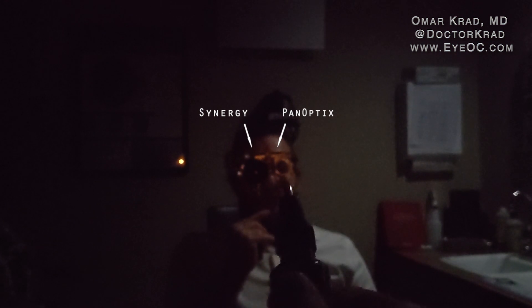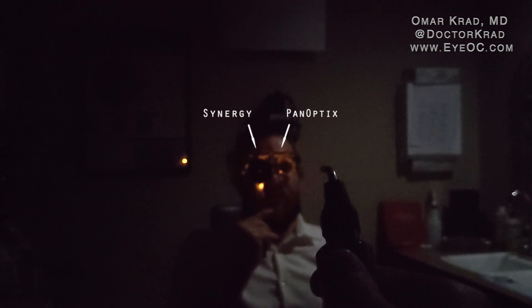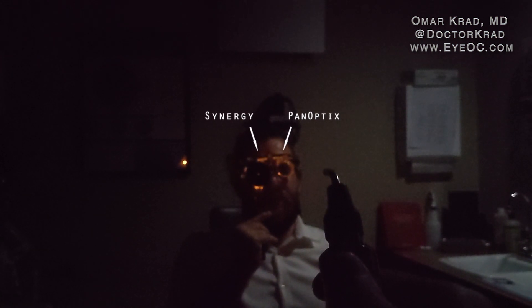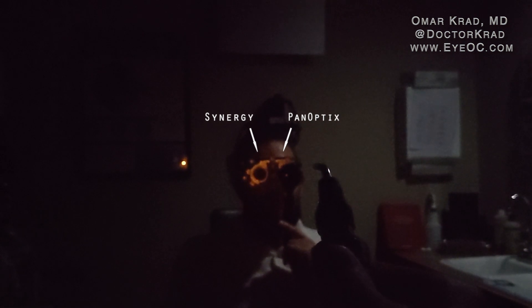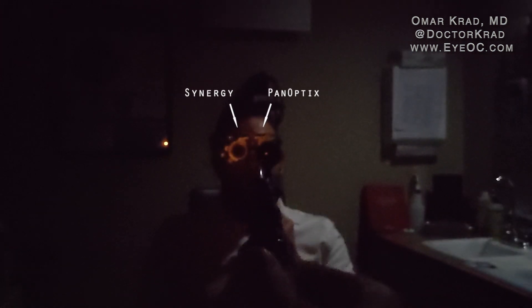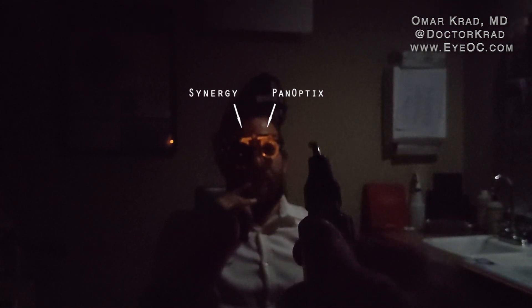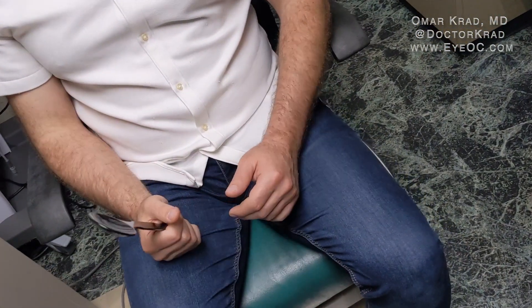Comparing the two eyes with the headlight, the right Synergy lens has a bigger halo and starburst for sure. The patient notes that the left PanOptix eye has improved significantly since right after surgery when it was pretty bad. Overall, vision with the headlight is better with the PanOptix, and the point of light looks a little bit sharper and clearer with the left eye.